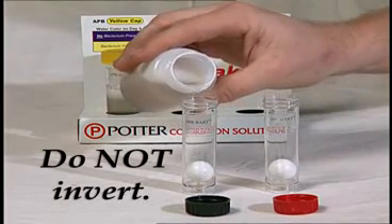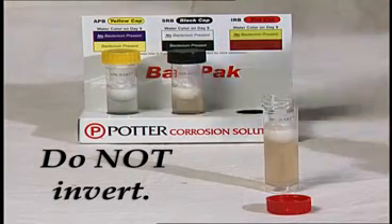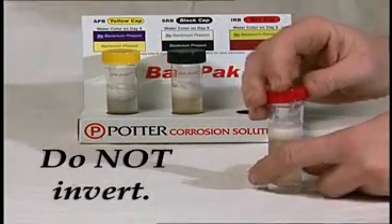Next, fill the SRB and IRB vials to the line, but do not invert the SRB and IRB vials.